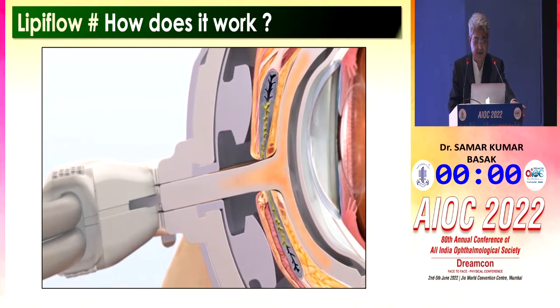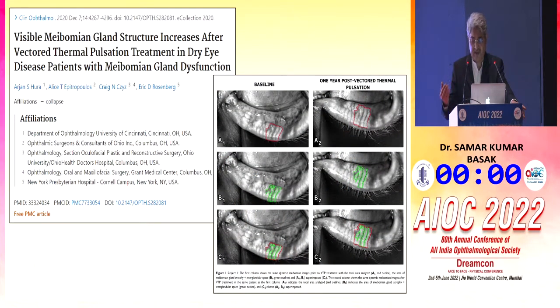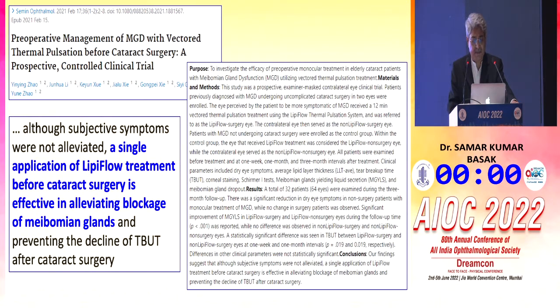But it is very, very important, and it is needed for some patients with MGD. And people have shown that there is improved Meibomian gland structure after doing LipiFlow. Other papers are coming currently, because this is a new system for the last 5-6 years.